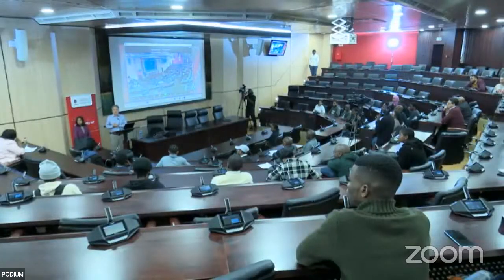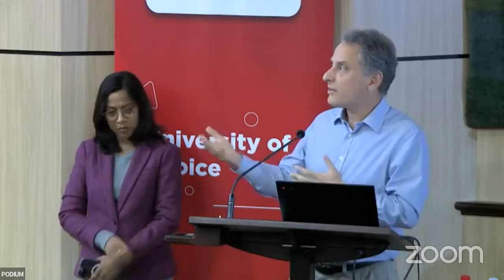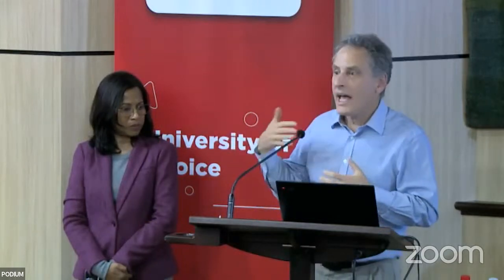So the short answer is no. When I think about microneedles for the eye, one option is what I described, namely the suprachoroidal injection, and it's got the nice targeting to the choroid and the adjacent retina. A limitation is that it requires some significant expertise to administer it. So I think it makes most sense to use that in combination with a long-acting formulation. And triamcinolone acetonide is a nice example of that. But if you have to give it every day or every week, I mean, forget it. So that is going to be a characteristic.